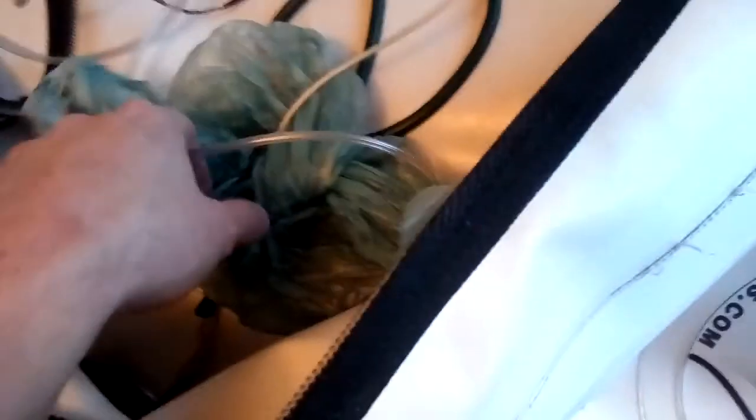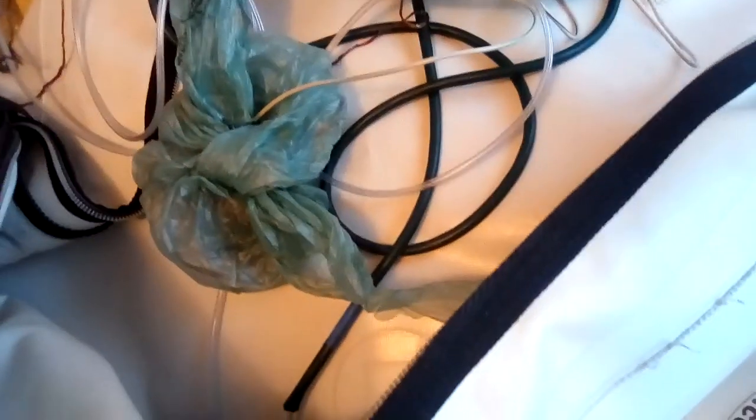When it's fully inflated, take the bags out, wrap all these wires around my head, then connect the other end around the oxygen line on the inside, connect the oxygen mask to that. When I'm done and I'm deflating, I usually just leave the wire that's connected to the oxygen. I leave it connected, and these other ends, all these wires that are wrapped around my head, I'll put them in bags so they don't get entangled. And I'll just repeat the process and do that every time I go in. That's how I ground.